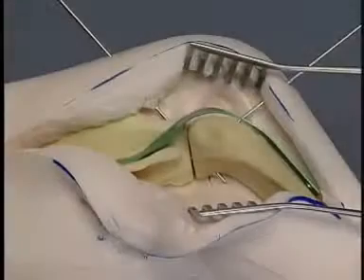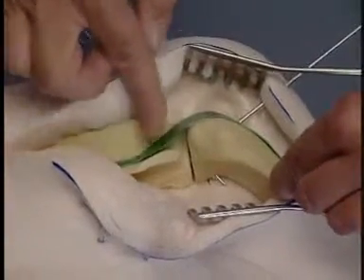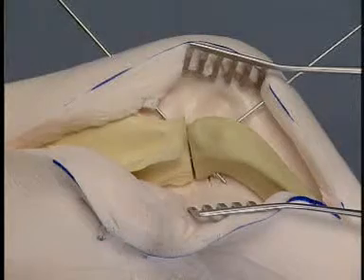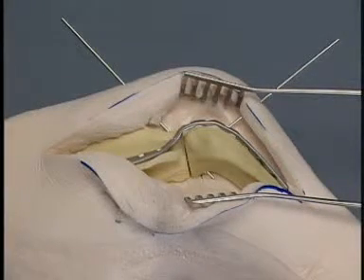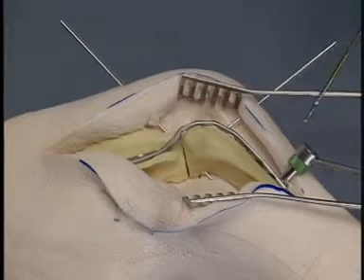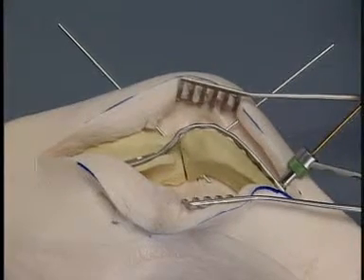The bending template is used to determine the contour of the cranial surface of the spine and the cranial aspect of the proximal humerus. A 12-hole 3.5 LC-DCP is contoured to match the bending template. The plate is secured to the bone by first placing 3.5 mm screws through the most distal and most proximal plate holes.